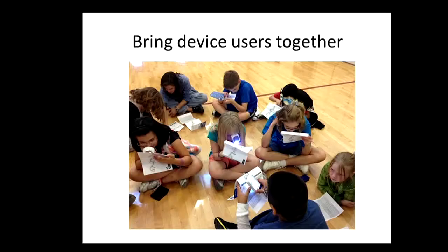Also, if you have more than one student with low vision, bring them together as much as you can for community outings geared toward optical device use. Here we have a group of students using magnifiers to study a bus route map before they go on a city bus trip to the state capitol. When you have more than one student, the social stigma about using a device in public tends to break down. You get into a competitive viewing mindset.